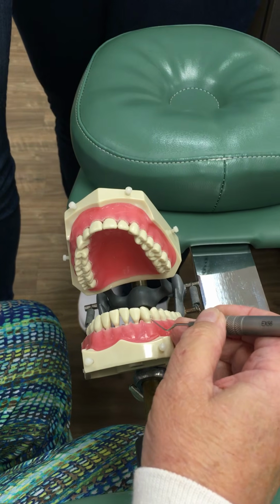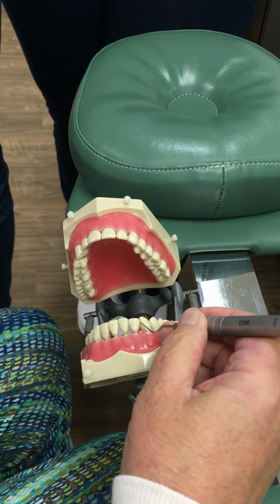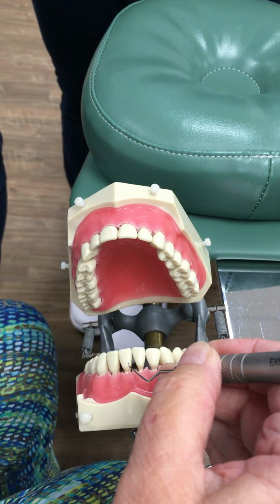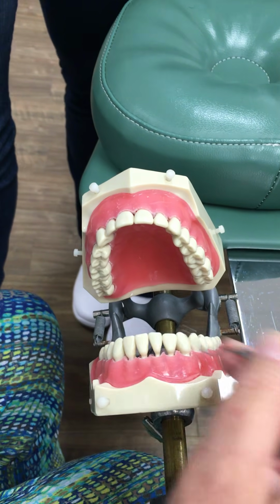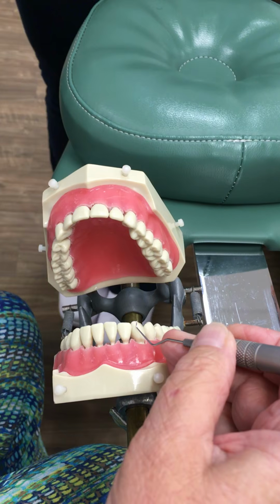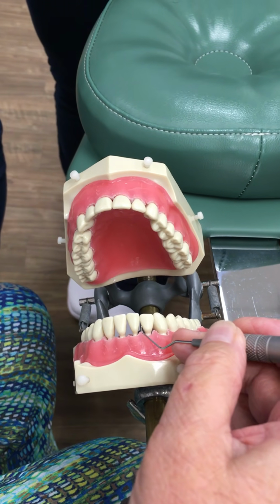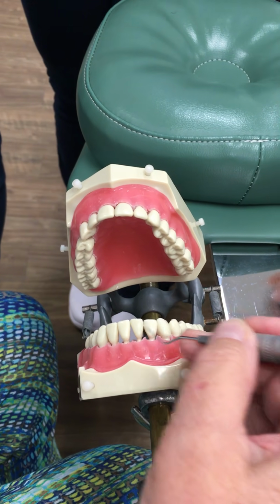The opposite of the midline there is the away surfaces, I guess is better. Does everybody understand that? So we have away and toward on each tooth. And there's a reason why we do toward and away in the anterior.